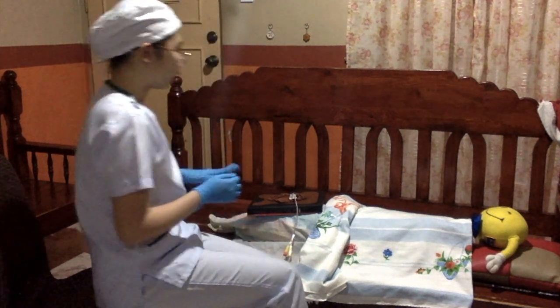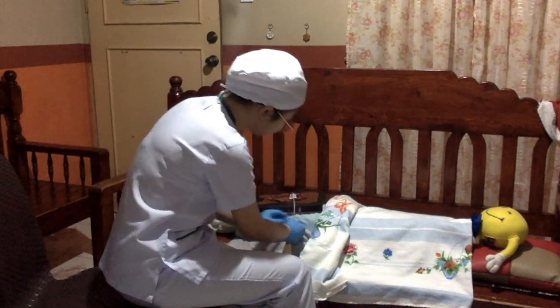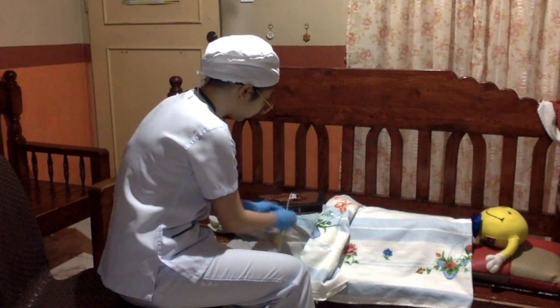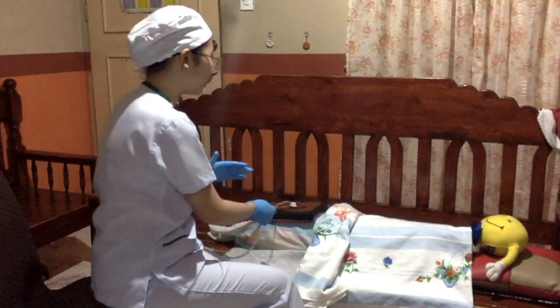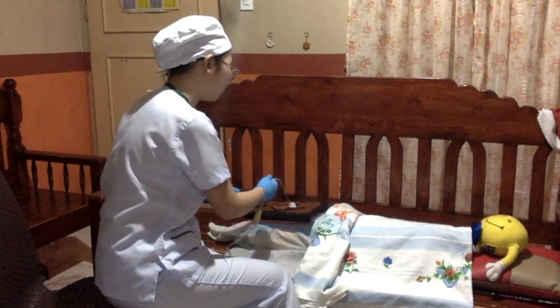And after that, I will now remove the tape. Miss Smiley, relax lang po at hinga po ng mabagal at malalim habang hinihila ko po palabas ito.